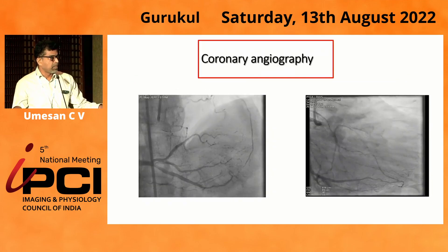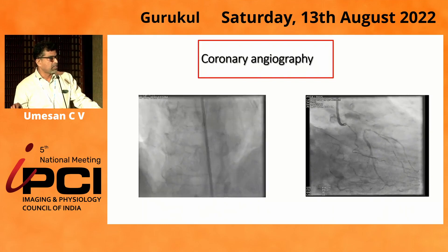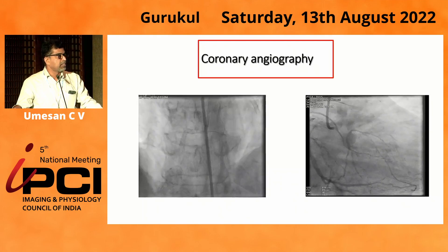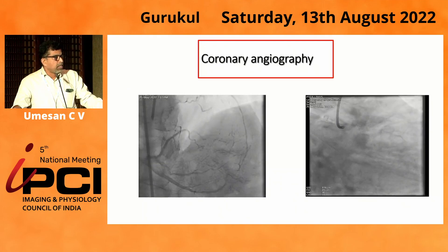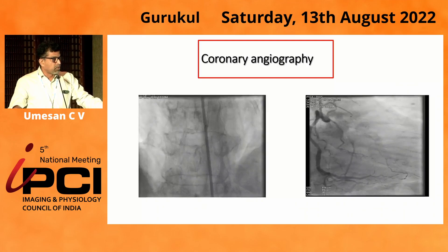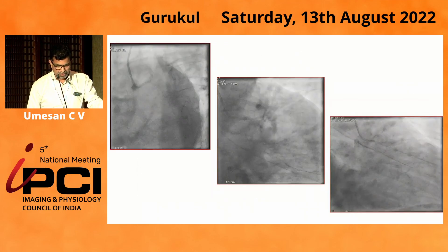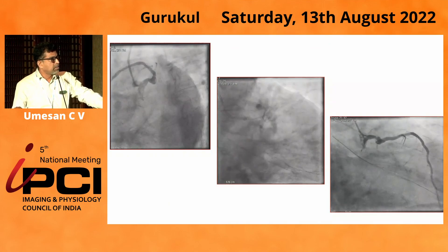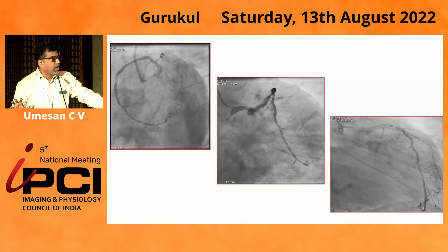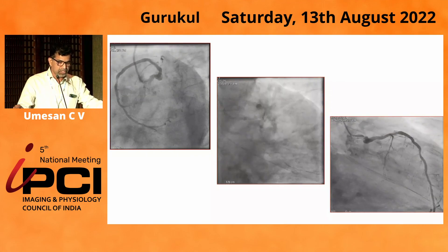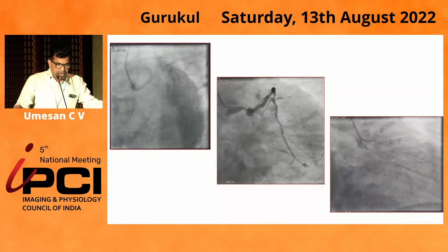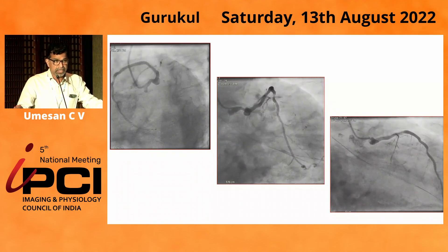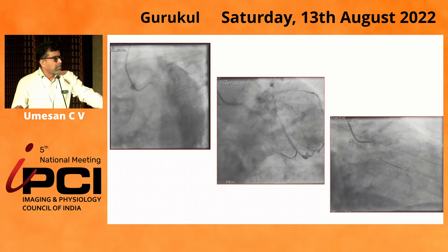This is his right coronary angiogram. He has patent stents in the right coronary artery with no significant flow-limiting disease. His circumflex system was fully filled retrogradely from the right coronary system. The interest is in the left coronary. In these caudal views, we can see that there is some bulge in the proximal left coronary system, the circumflex is totally occluded, and the stent in the LAD is patent with no significant disease in the distal LAD.